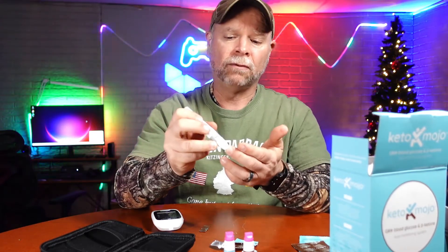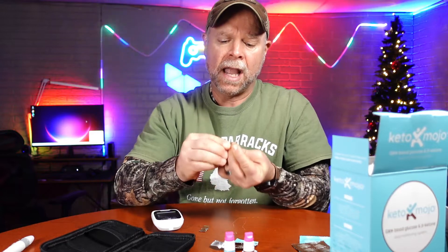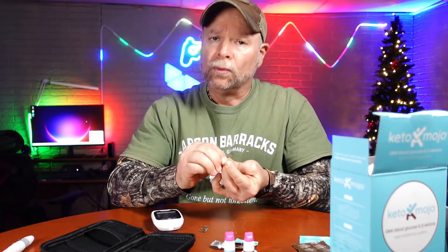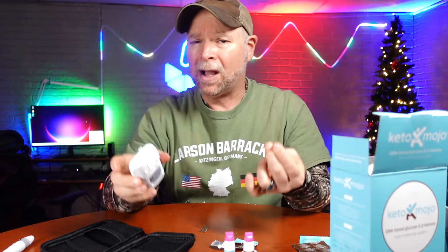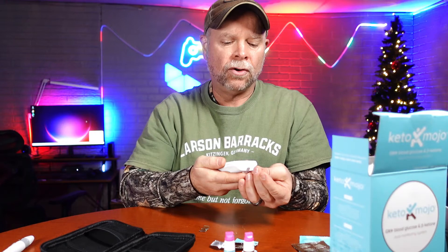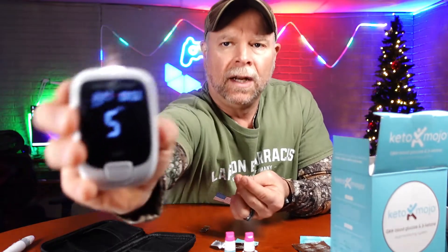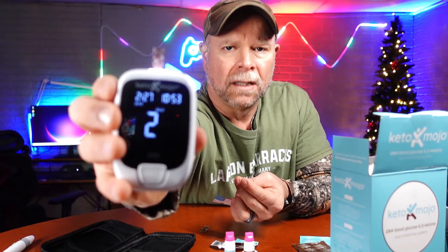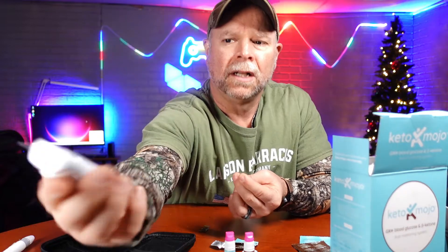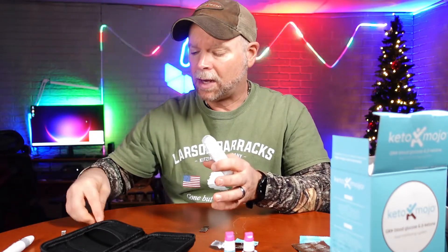I'm just going to go on the tip of my finger here. I did just drink a little bit of bone broth, so that is going to trigger some insulin and raise my blood sugar just a little bit. I'm right at 16 hours into a fast, so drinking that bone broth is going to affect my reading. Once you get that reading it's going to take five to ten seconds. My reading is a 71 — that is a super low blood sugar reading, the lowest I've ever had. Typically I'm right around 100.